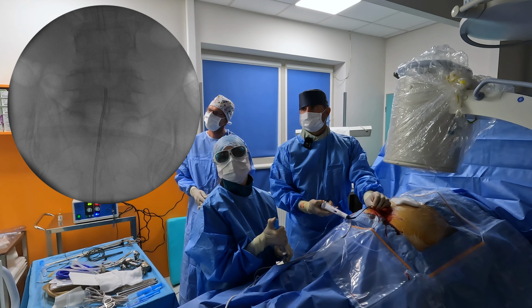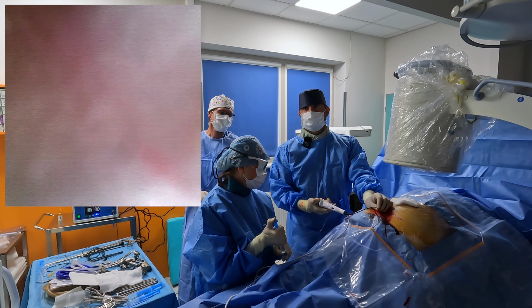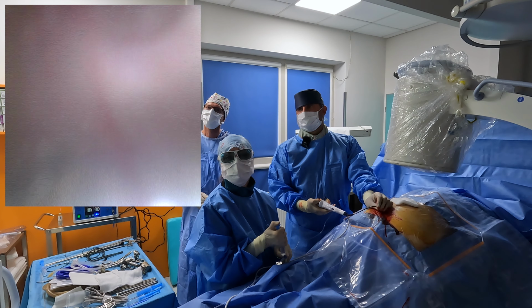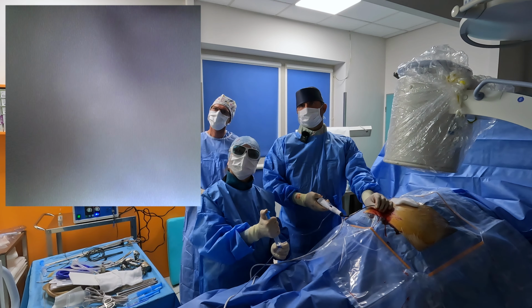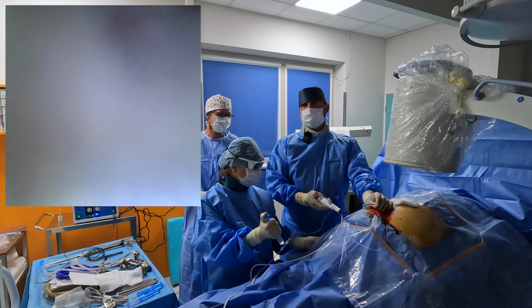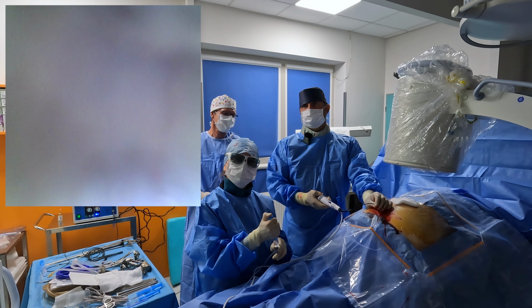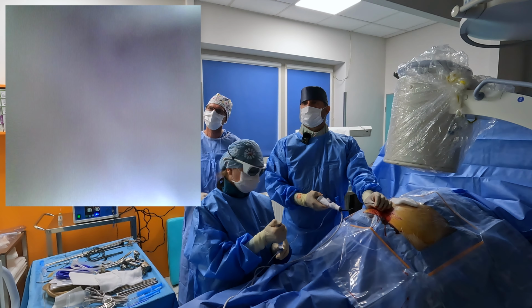So now the patient is reacting a little bit here at this level. Now you see a little bit of hypervascularization and a little bit of inflammation. This is about the level of L5S1. And here you see at this level we have some adhesions, adhesion tissue. This is this white tissue you see, which is not robust, but anyway, there is some kind of pathological tissue at this level, and you never know if this can cause any irritation of the nerve root or not.